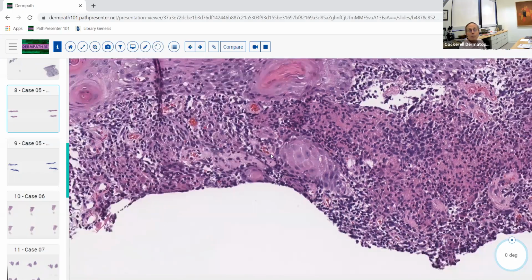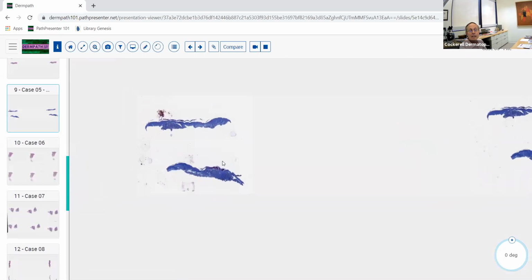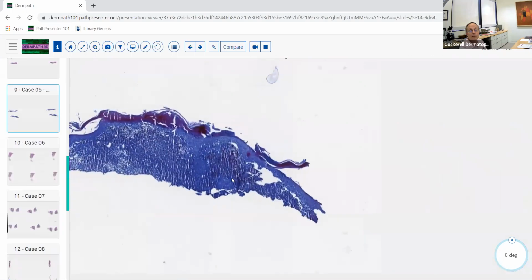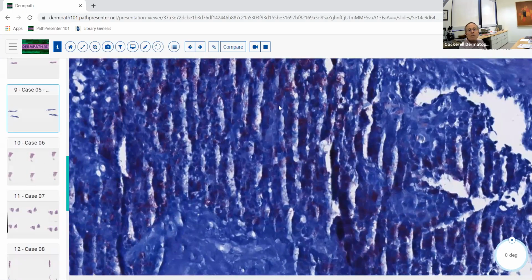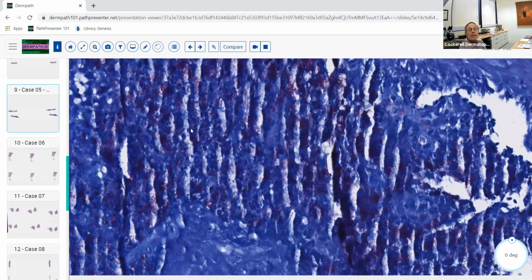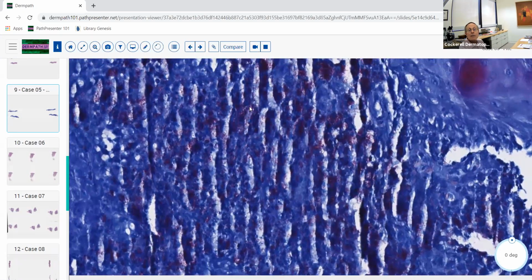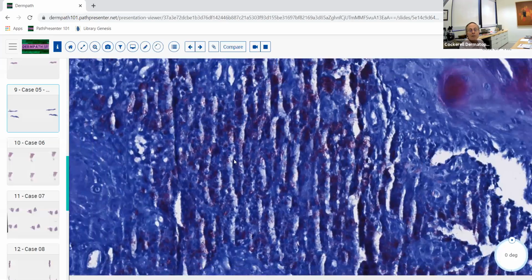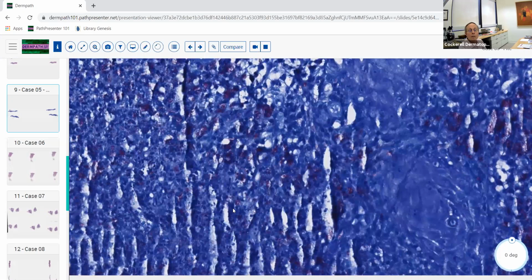So here we would do special stains. And I believe the next slide is a stain, which in this case, we maybe will be lucky and actually see some of the organisms here. Yeah, in this case, it's kind of hard to appreciate, but all this kind of pinkish material here, this reddish material, these are positive organisms of AFB. I can't get much higher than this on the scan slide, unfortunately, but this thing was loaded with organisms. Now, this is sort of the exception rather than the rule.